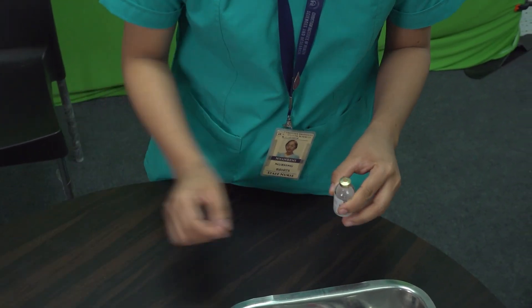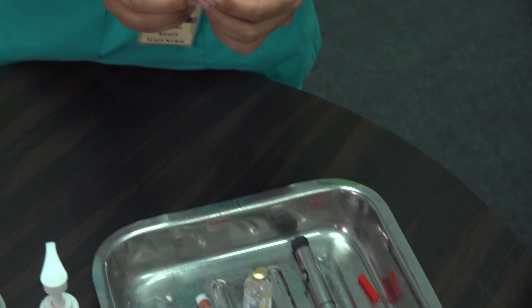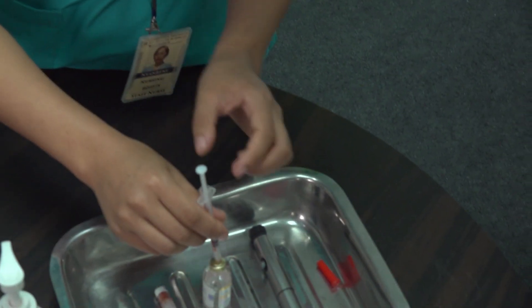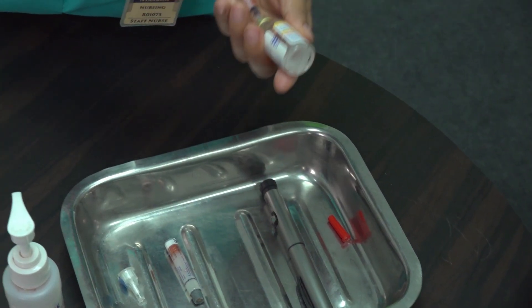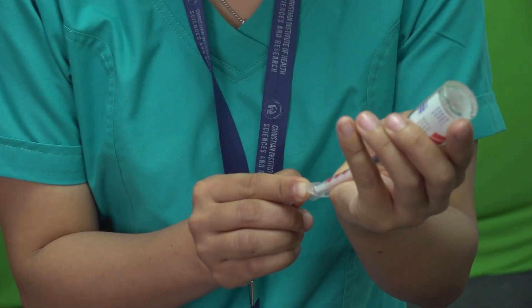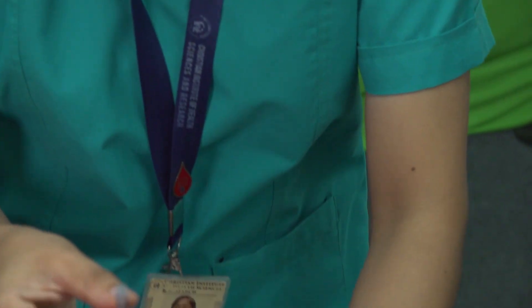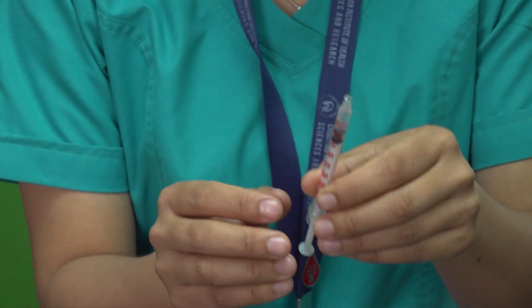Draw air into the syringe equal to the required insulin dose. Insert the needle into the vial, push the air in, and carefully draw the prescribed amount of insulin. Remove air bubbles by gently flicking the syringe and expelling excess air.